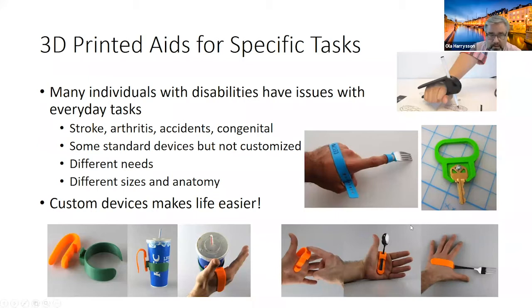And as you can see here at the bottom, these are devices where the orange piece here has been designed for this particular patient. And then they have all these different attachments that help them with some of these daily activities. So custom devices just make life easier.